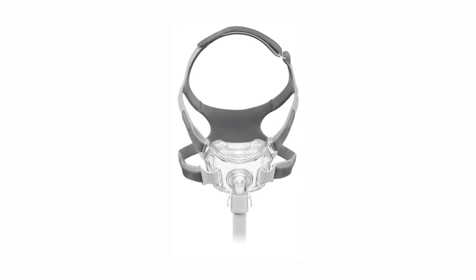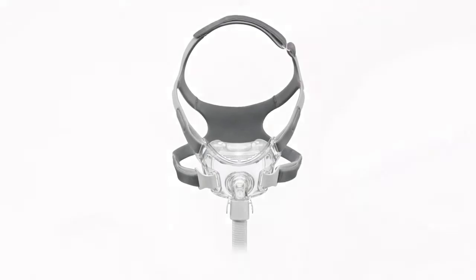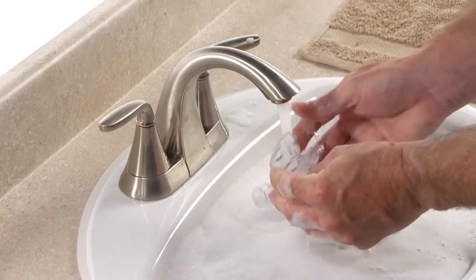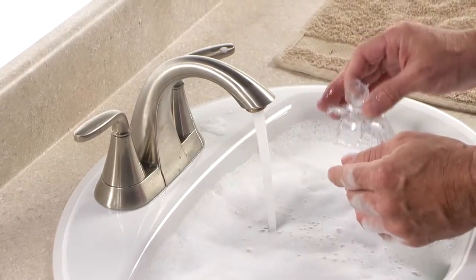Cleaning your Amara View mask and headgear regularly and before first use is very important. Each day, disconnect the mask cushion from the frame and hand wash the mask frame, cushion, and quick-release tubing in warm water with mild liquid dishwashing detergent.